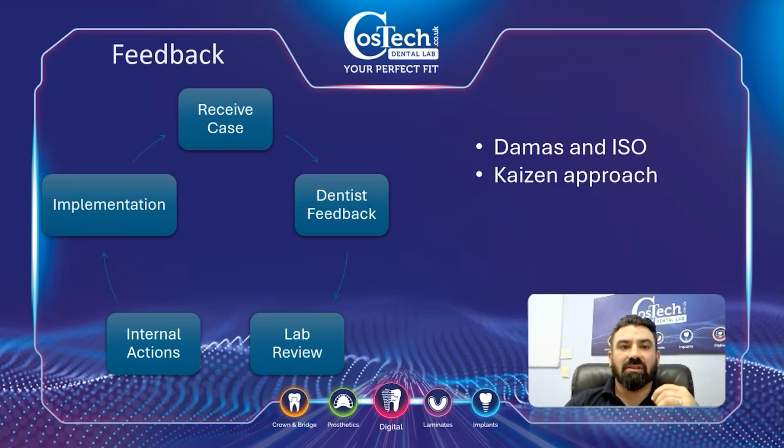We do it for DAMAS and ISO. Very important, but also we'd like to take it within the Kaizen approach, where lots and lots of small improvements means a big gain overall. So a standard feedback loop. Let us know what happened. People sometimes say, oh yeah, by putting it in, nothing happens.